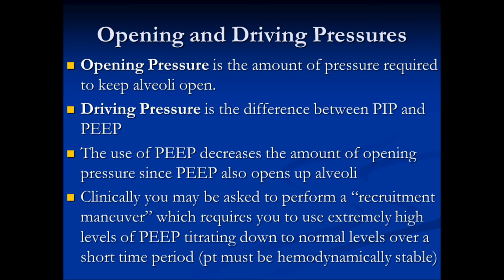So clinically, you may be asked to perform something called a recruitment maneuver. This is mostly done on adults, but also can be utilized on a really sick baby. A recruitment maneuver will require you to use extremely high levels of PEEP. Of course, we use these on people with stiff lungs.